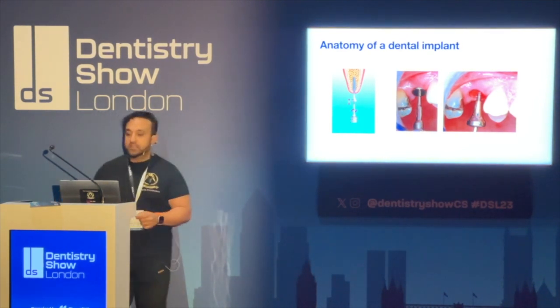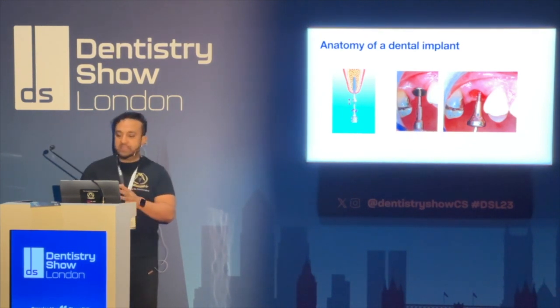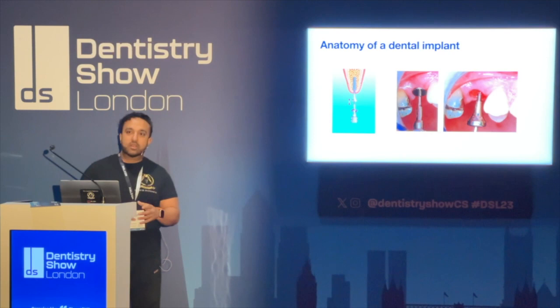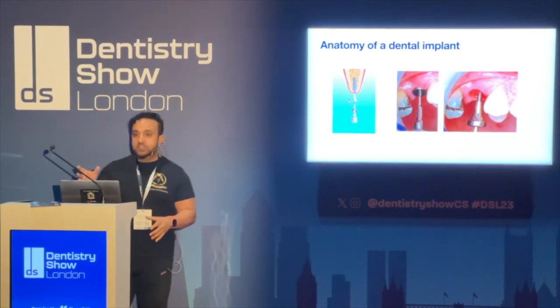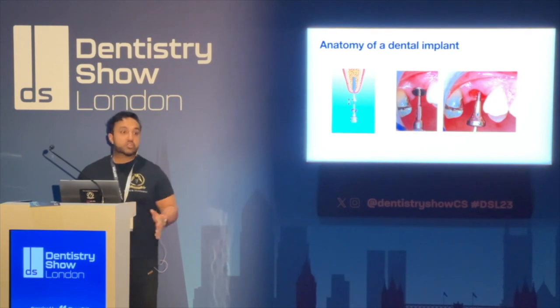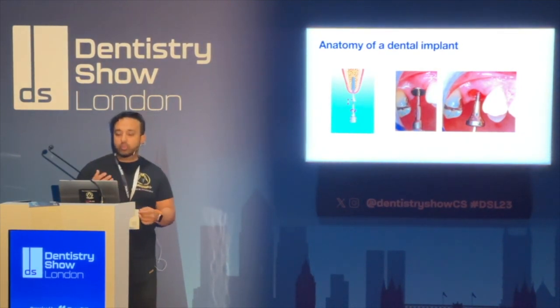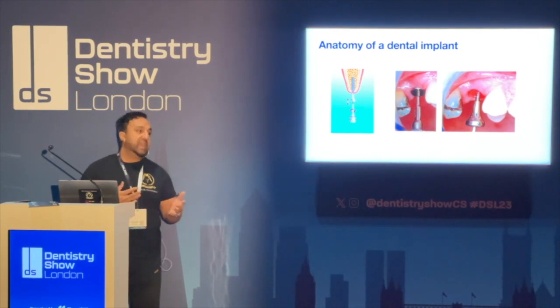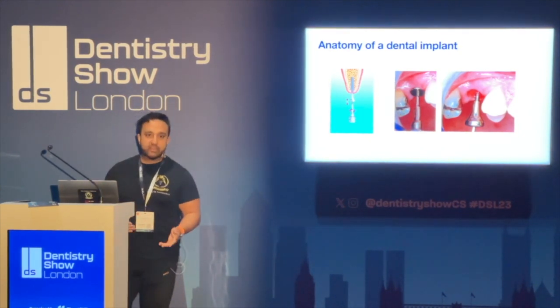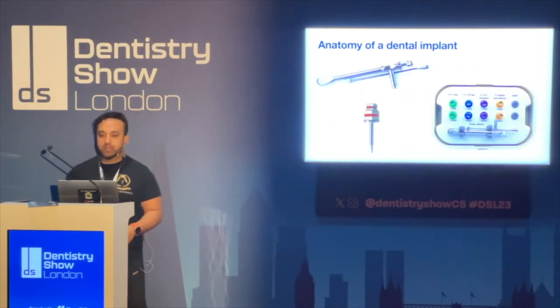So in that 4 months, we may place a healing cap, and that creates an atraumatic connection between the oral cavity and the inside of the implant. And you can unscrew that without local anesthetic, and you'll have a very clear area of keratinized mucosa going straight to the head of the implant there. What we're actually taking it out with is something called a hex driver, and I'm going to talk about that shortly. So these are the basic things of the anatomy of an implant.